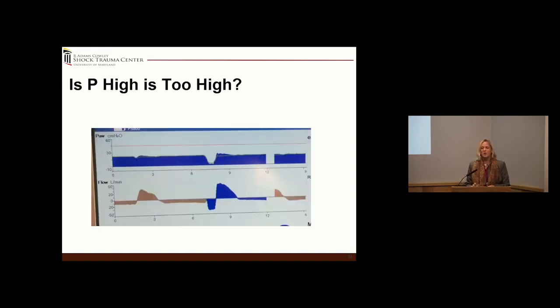So how do we know once we transition what's too high and what's too low? So is my airway pressure too high? Well, if you look here, and this is an extended T high, but you can see there's an inspiratory phase where the patient takes an inspiration, but look at the expiratory phase. It's prolonged. So if you can just envision the patient is constantly breathing out. So they're, as Dr. Bashi said earlier, defending their lung volume. So that might be an airway pressure that's too high.